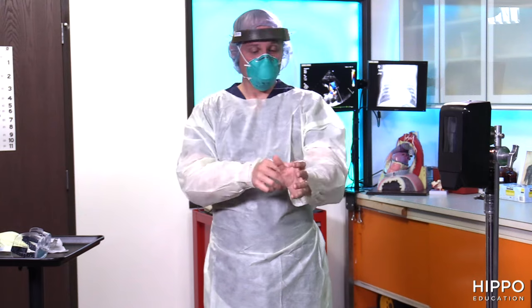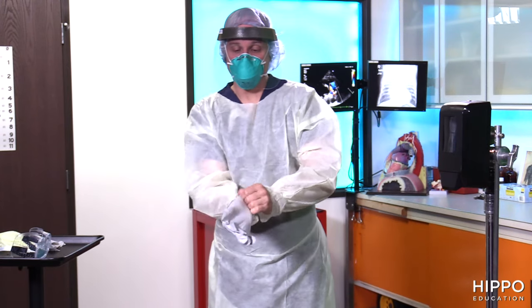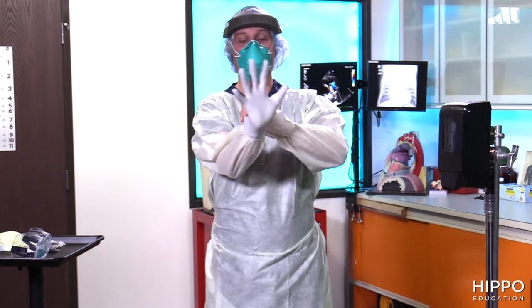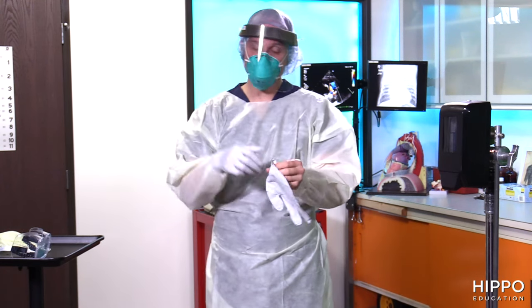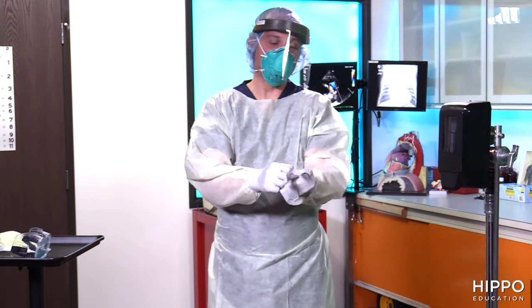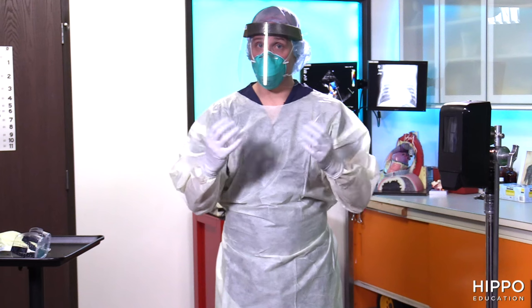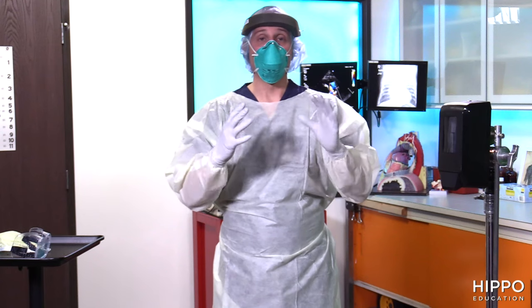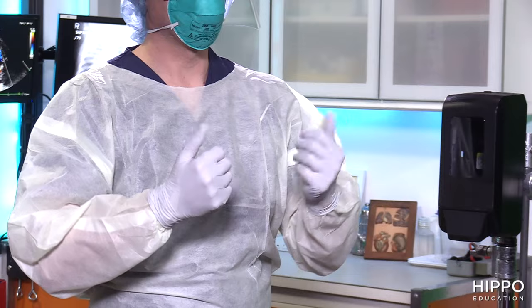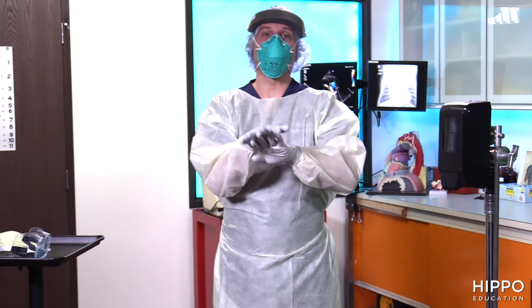Finally, it's the gloves. Put your thumbs into the sleeve holes and put your gloves on, making sure to pull the glove above the cuff of your sleeve so there's no skin showing between glove and gown — that's what the thumb rings are for. A quick note: some people double-glove so they can quickly remove a contaminated outer pair. It's not essential, but if you do have contamination, you can also repeat hand hygiene with the gloves on to decontaminate them.